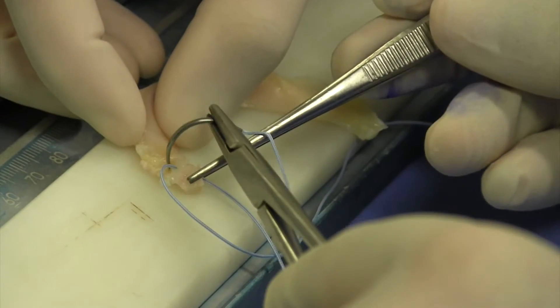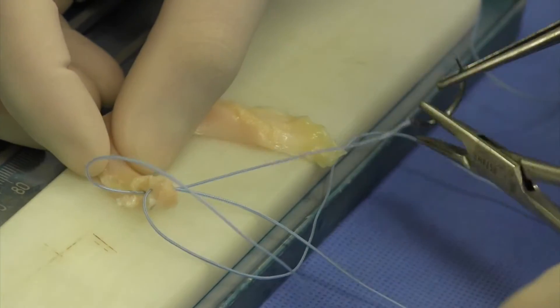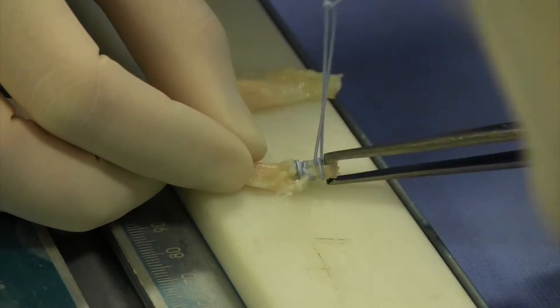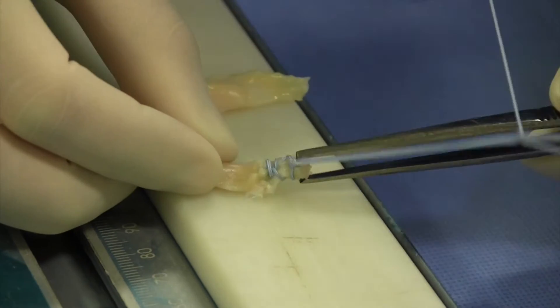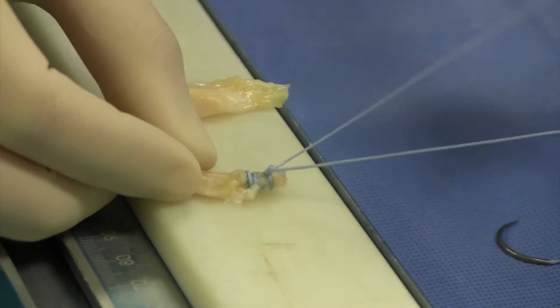After finishing this suture, I put three other sutures into the donor meniscus — one in the anterior horn ligament and two at each one-third of the meniscus, so that I can pull the meniscus into the joint with those sutures.